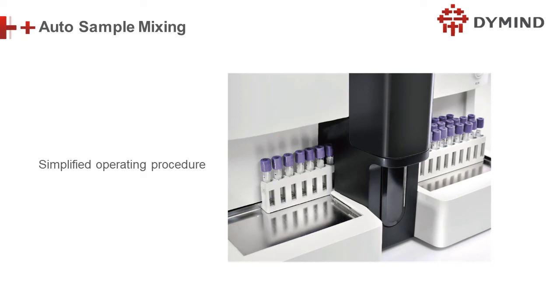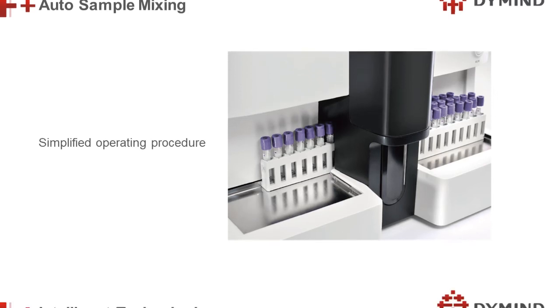And the auto sample mixing. Here is another advantage. When we use the autoloader, we no longer need to mix. Inverting, right? Do you remember the inverting? No need to invert anymore. Why? We have a mixer inside the machine. It will do the mixing automatically.